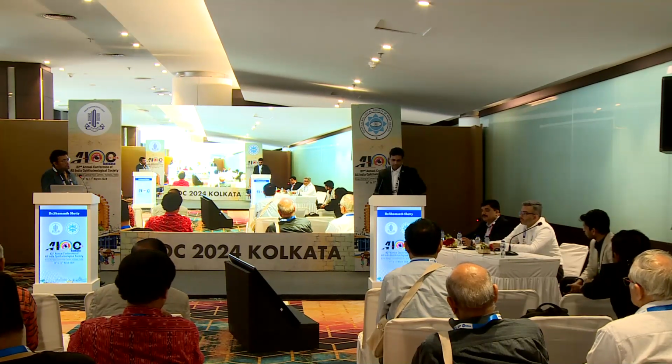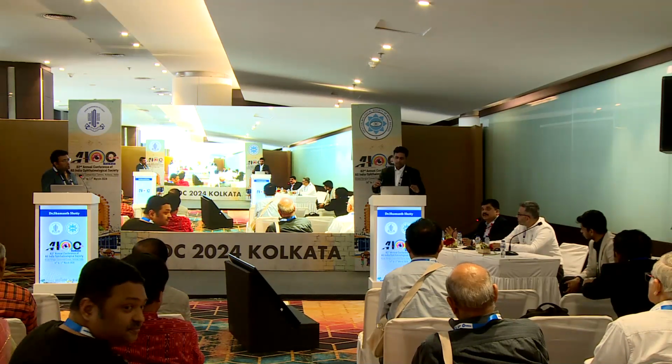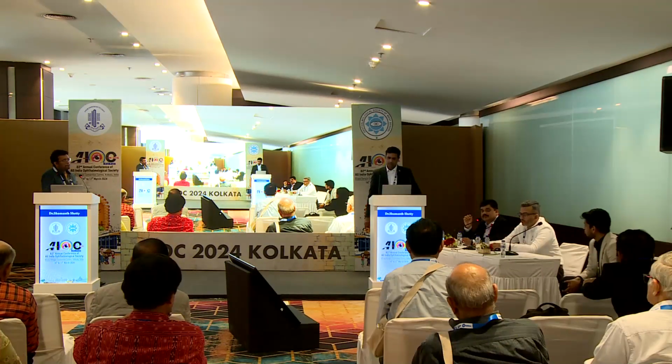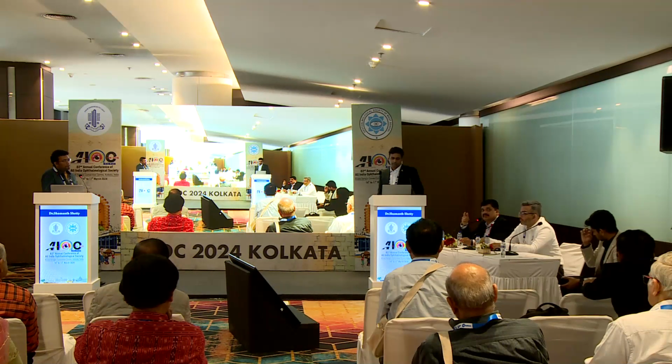So to have premium IOL practice, sometimes this decentration happens. When you see the patient post-operatively after 1.5 to 2 months, the center part of that multifocal will be shifting towards the pupillary margin, and you will see a lot of rings around. You might be thinking, I have done the surgery very well, but why has this intraocular lens been decentered?